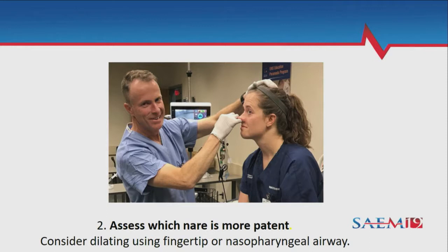My left side is more open today, so I'll probably get intubated on the left. You can use your finger to dilate it up after you get a little bit more anesthesia — you don't want to do that beforehand.